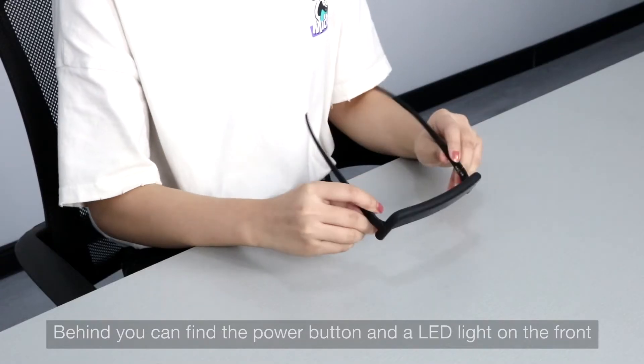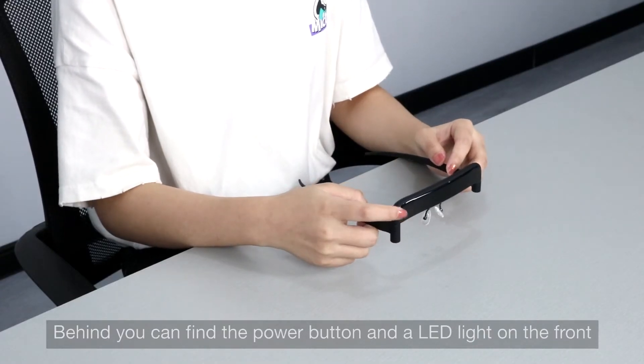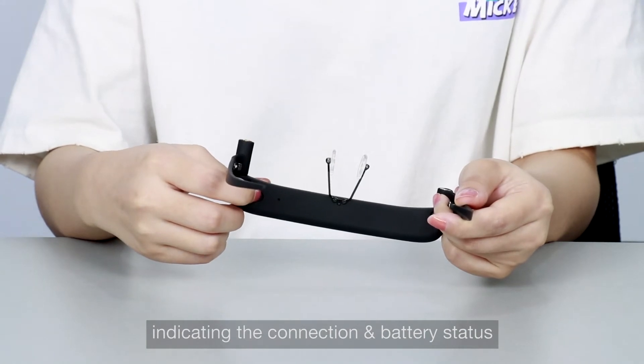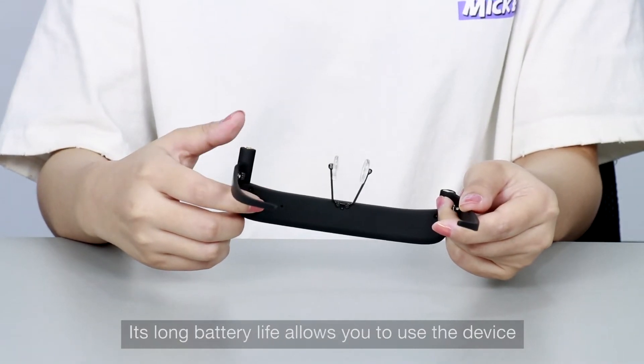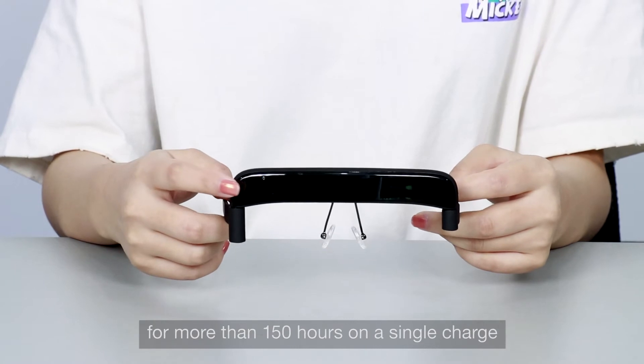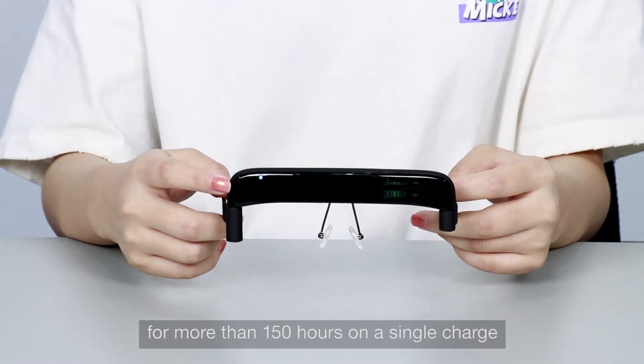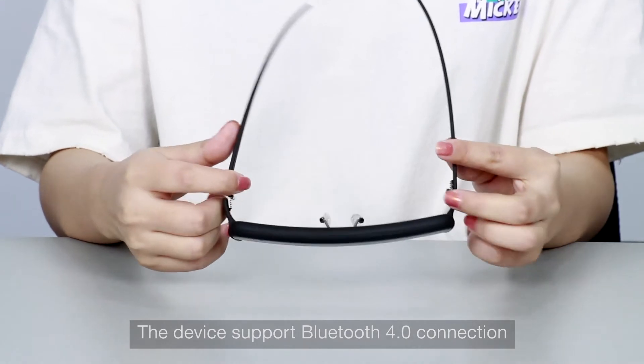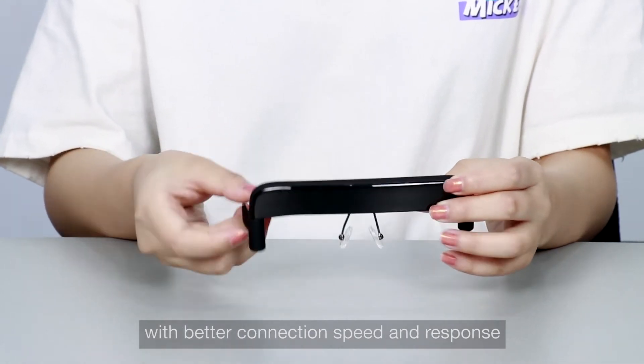On the front you can find the power button and an LED light, indicating the connection and battery status. Its long battery life allows you to use the device for more than 150 hours on a single charge. The device supports Bluetooth 4.0 connection with better connection speed and response.